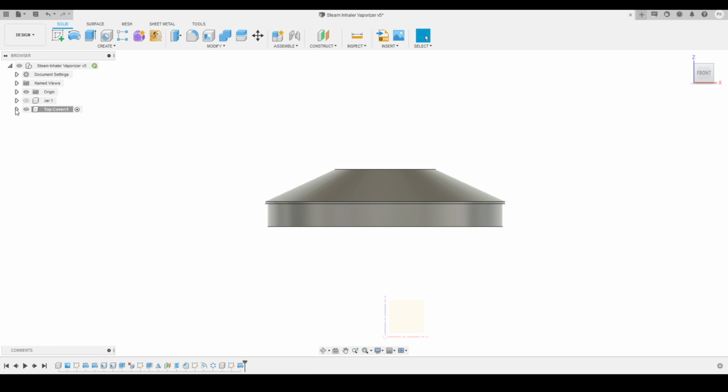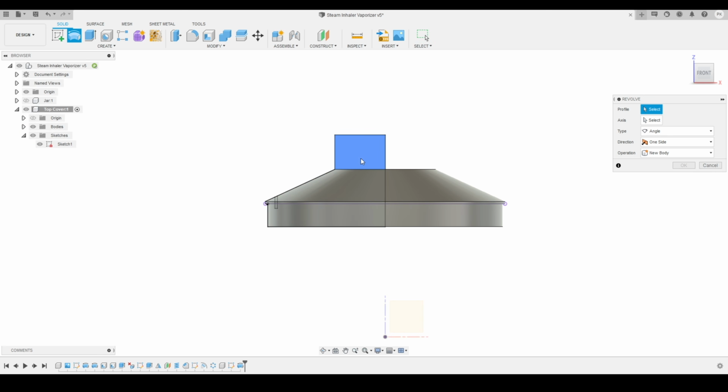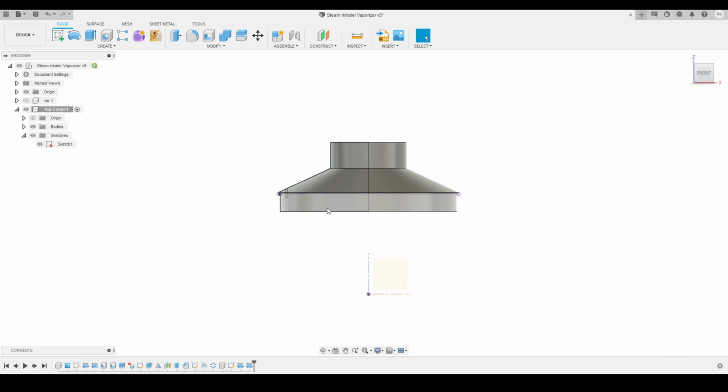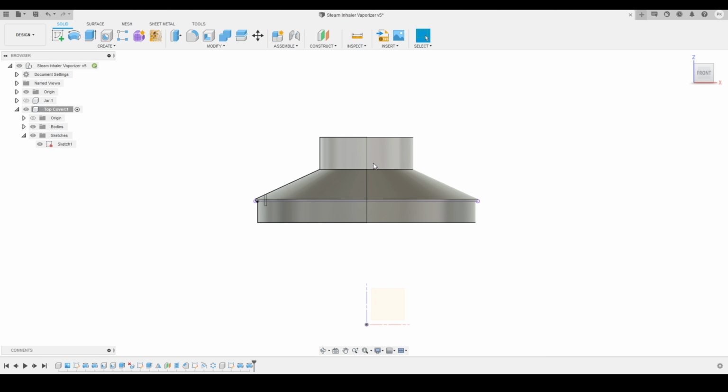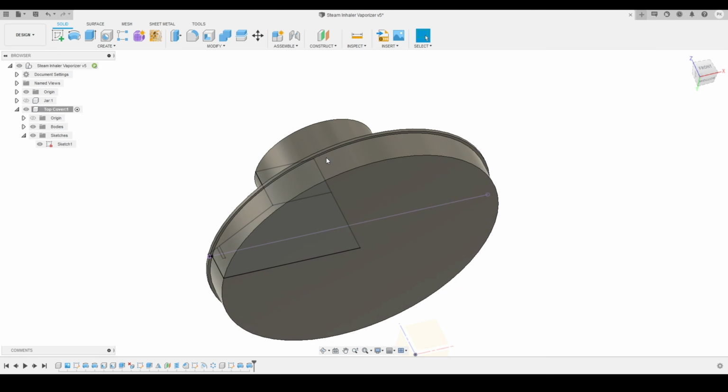Here we are just revolving the sketch as two different profiles. Now I will activate the other profile, we'll select the profile, we'll select the axis, and we'll press OK. Here you can see we have revolved two different profiles, but we'll make sure that this is a new body, so both will be separate bodies.